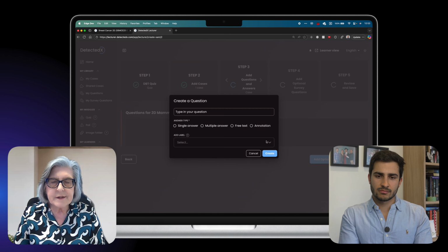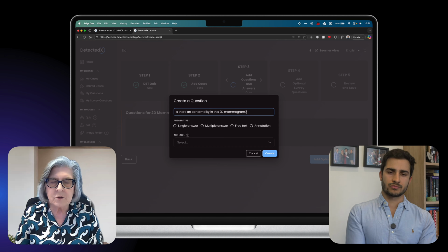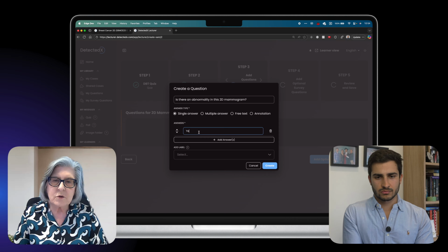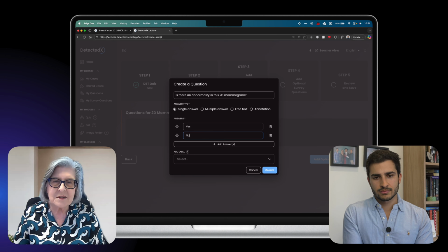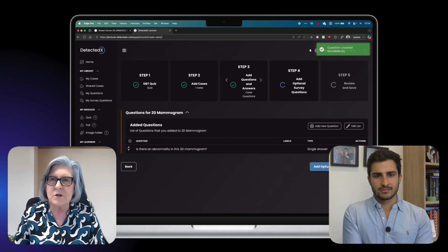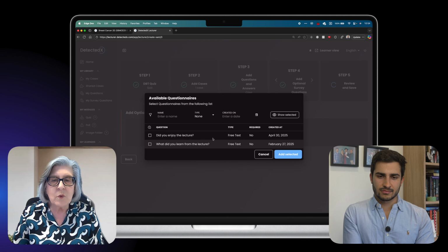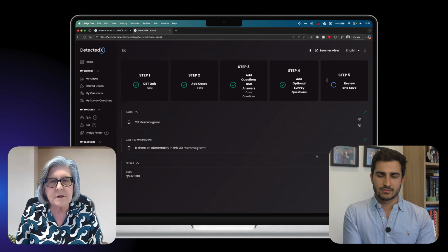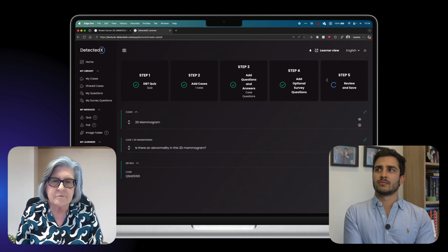The other facility that the platform offers is that people can actually have a questionnaire at the end of a test set. They can test people out before and after, ask questions about the subject, or they can ask questions for feedback, like how did you find this test set? Was it helpful, etc., etc.? Was the lecture a good way of learning? So there are different aspects to the teaching facet.